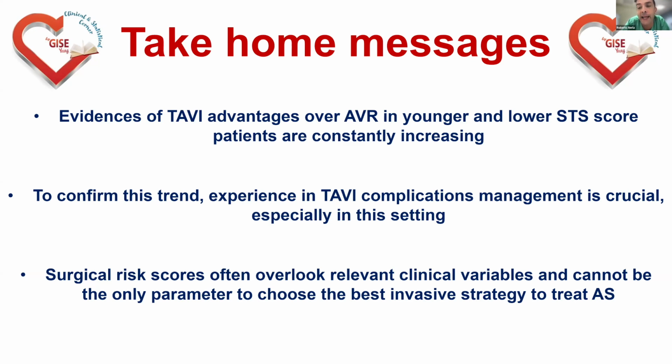So if one ProGlide is enough, we stop at one ProGlide, and then we decide. But we use a balloon also to facilitate hemostasis. In general, when you have any trouble, I can tell you that it's very helpful to have a balloon and a wire already there. For example, if you have a small laceration in the vessel, then it might be tricky to put your wire in the distal part because the wire can be trapped inside the small laceration. So you anticipate any possible complication, even if there are low rates of this one.